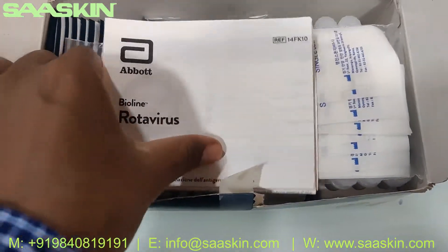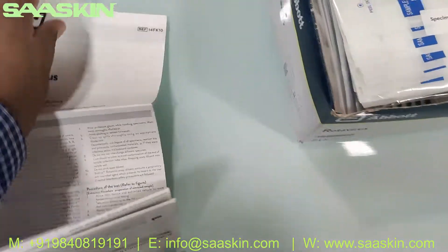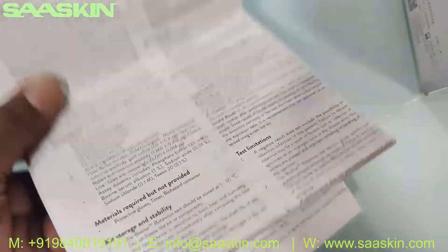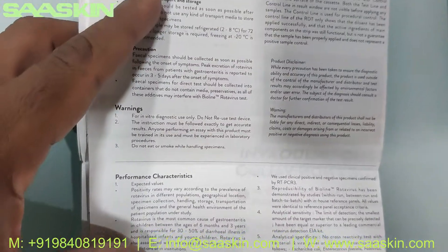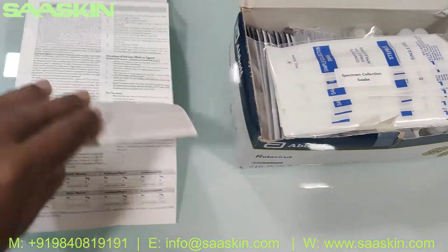Inside the box you can see you have one IFU brochure — a detailed brochure. You can see it says Abbott BioLine rotavirus antigen test kit. This brochure contains the complete details. It's actually a bigger page — you can see the abstract, specimen collection procedures, sterile specimen collection swab sticks, the procedure, material details provided in the kit, how the test is set up, test procedure, limitations, and how to interpret your results.